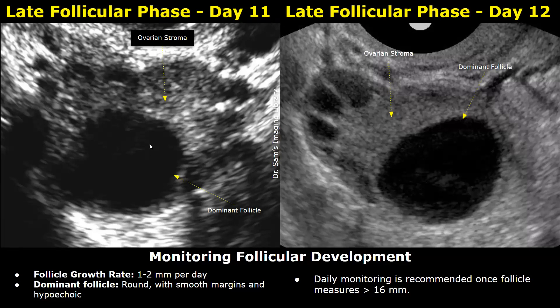In this day eleven image, you can see one large dominant follicle, whereas other follicles are much smaller in size. The appearances of dominant follicles can vary. This image is obtained on day twelve — you can easily see a large dominant follicle.